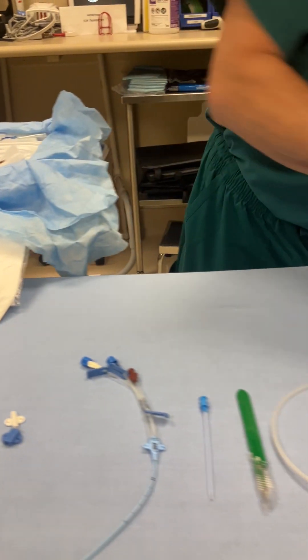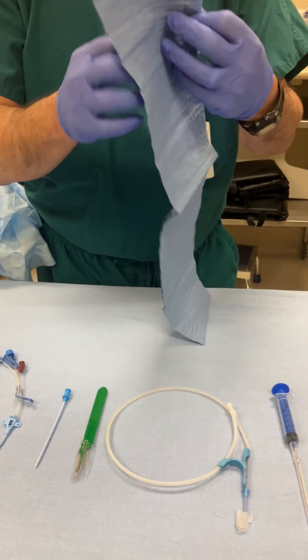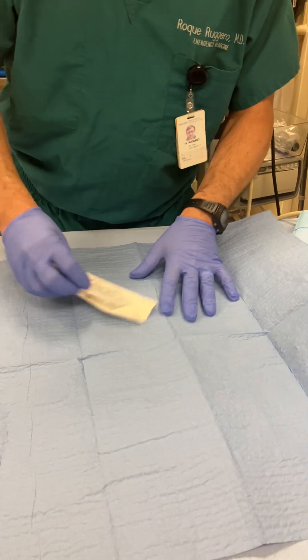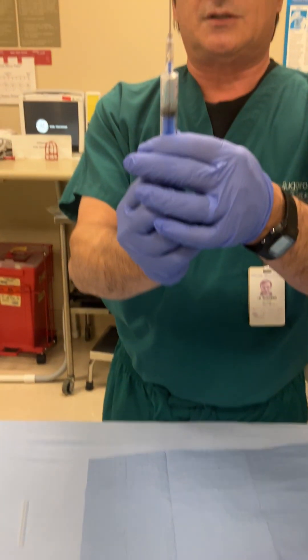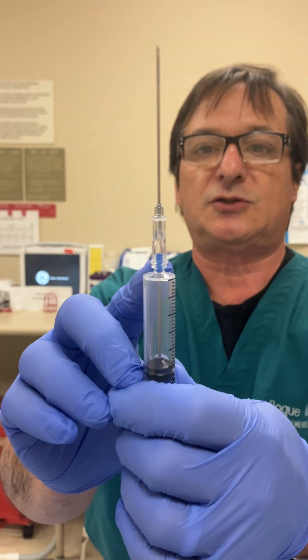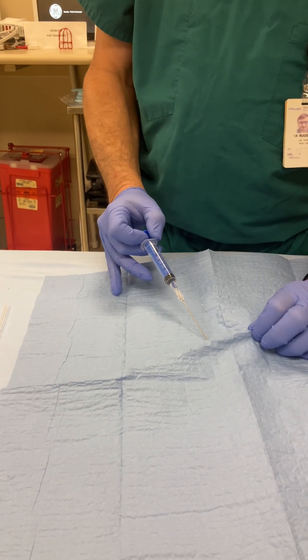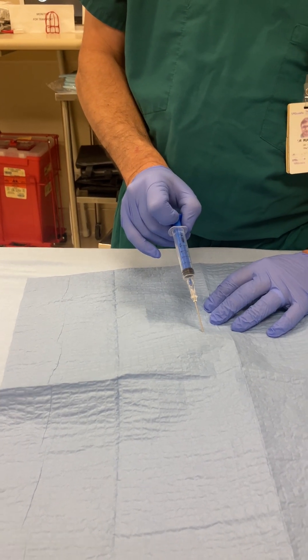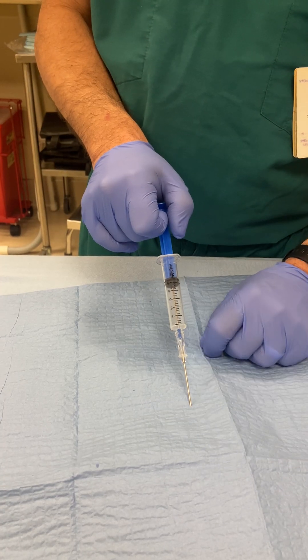I'm going to use this as my high-fidelity mannequin. I've prepped the skin and anesthetized with lidocaine. One thing to note about this syringe is there's a needle tube through the syringe with a hole — I'll explain the purpose when we're advancing the needle. I'm going to pierce the skin and start aspirating as I advance the needle. Once I hit the internal jugular vein, the syringe is going to fill with blood very easily, and I'll know the tip of the needle is in the vein.